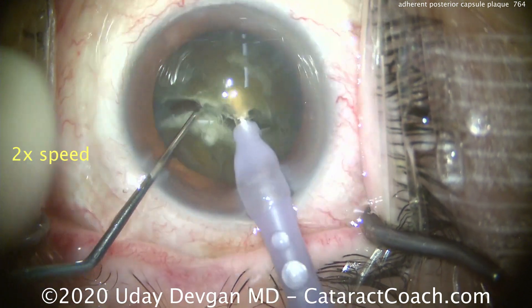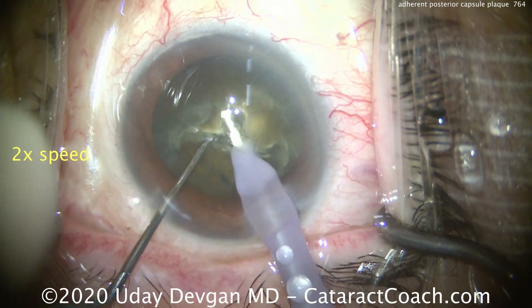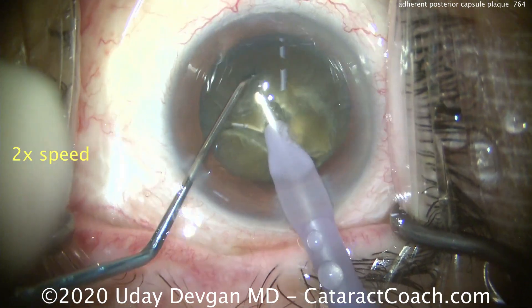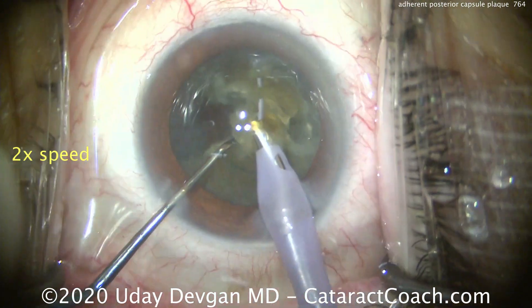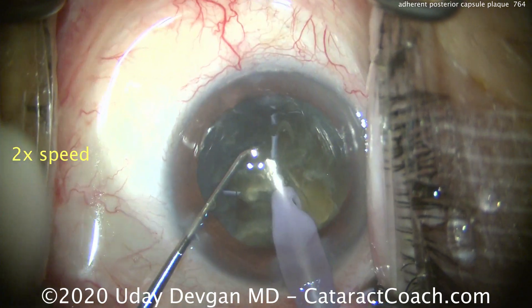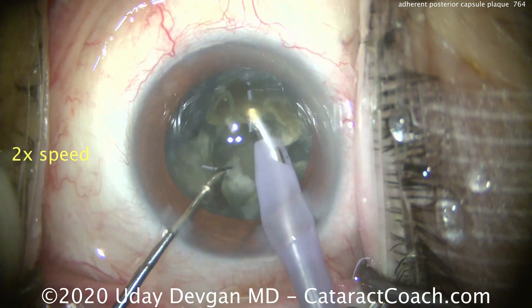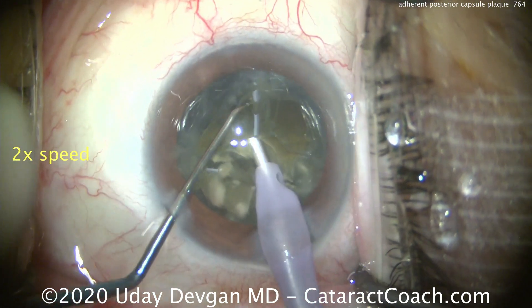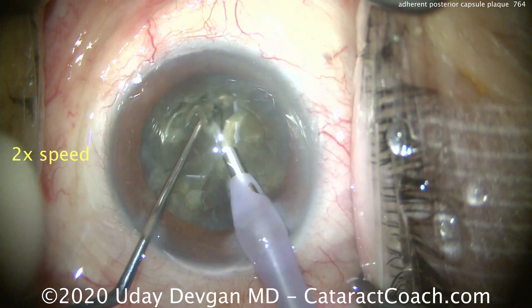Here's the patient, and you can see at double speed here — this is a dense cataract. We're going to chop it up into many small pieces, but it is dense. We've got to use a lot of phaco power. The pre-op visual acuity for this patient was counting fingers at 3 feet — less than 20/800, not even on the eye chart. This is a very dense cataract, and we're going to make the vision a whole lot better by removing it.